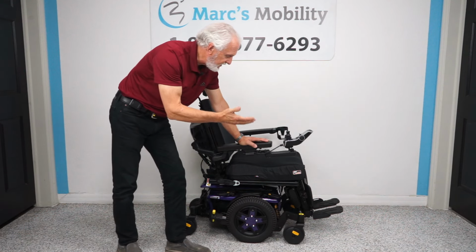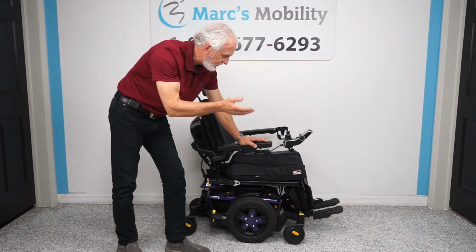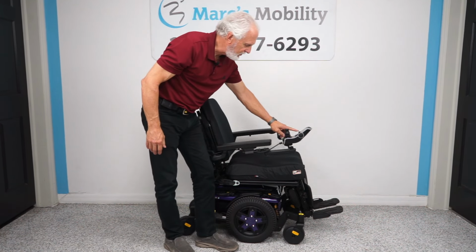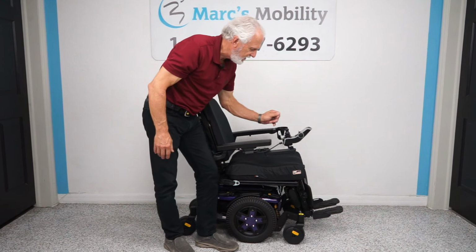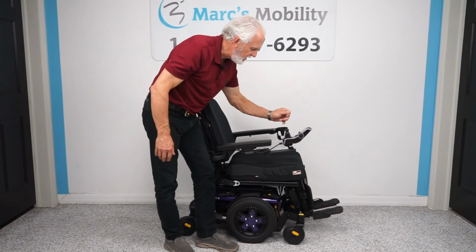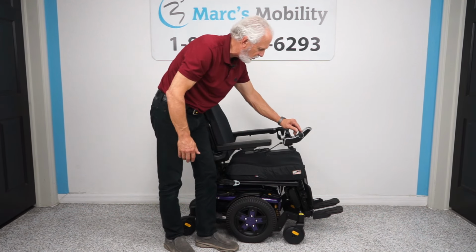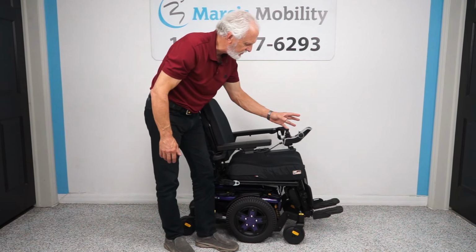So if you want to make the seat tilt, recline, or the legs go out, you have to do it through the joystick on this chair. So you would go to the button on the left side where you turn it on. Keep pushing that button forward until you see a picture of your seat in the screen. So I'm going to keep pushing it forward. And now I have a picture of the seat.